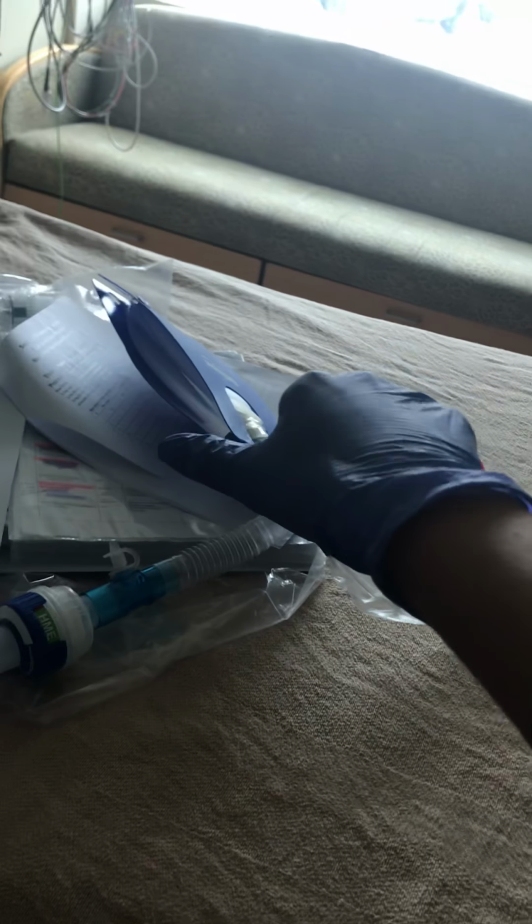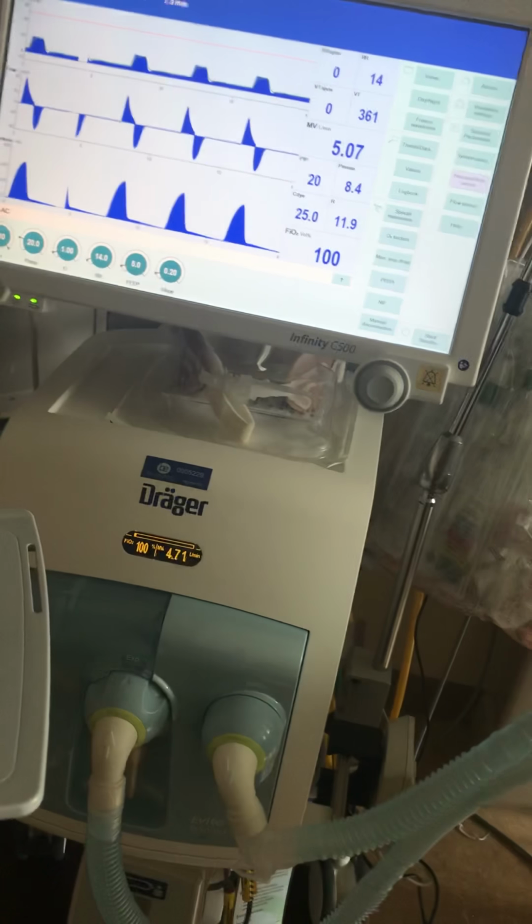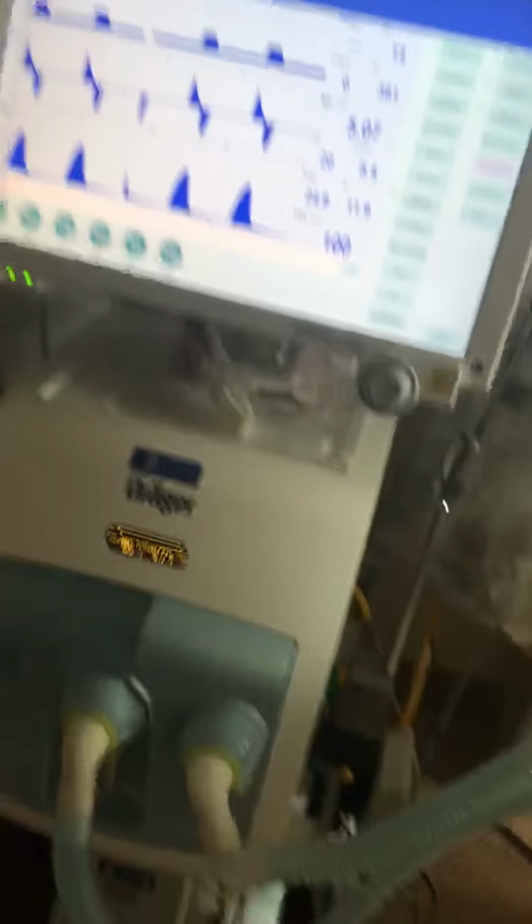We always want to make sure we're telling the patient what we're doing. When we're suctioning, when we go all the way down, before we start suctioning, tell the patient we're going to make them cough as we suction out so that they're prepared for that. They might not fully be with it or might be sedated, so it's just good reassurance to let them know, in case they are listening to you, so that they have an idea of what you are doing.